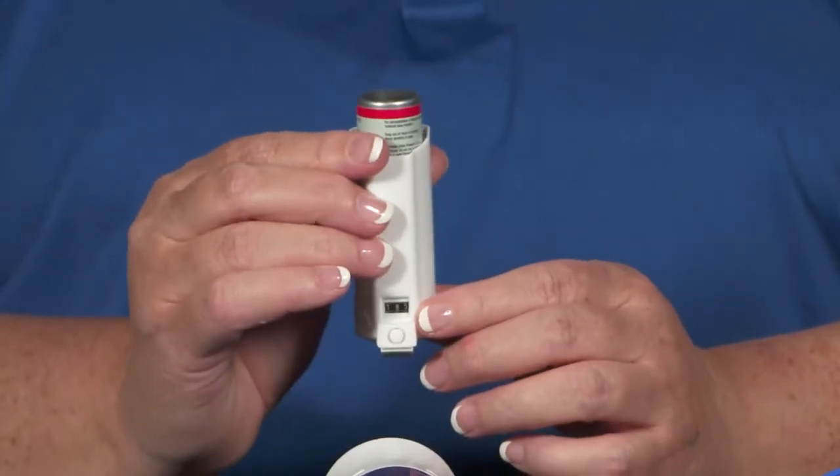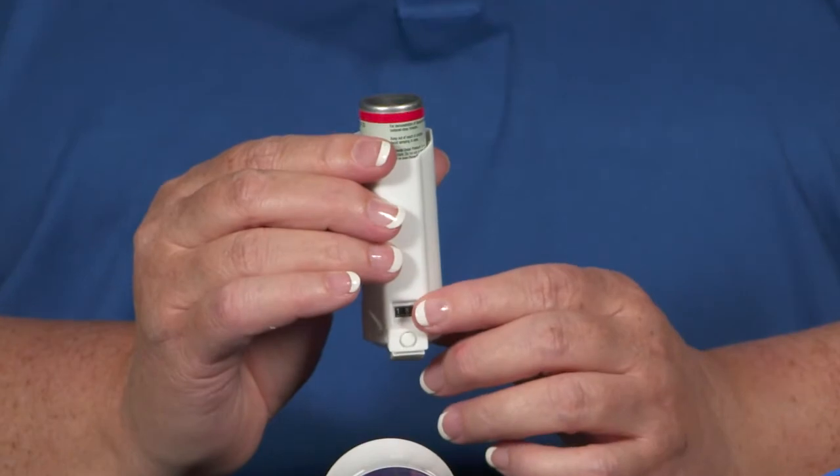When you first get your MDI and it's new, please ask an adult to help you prime it, which means to get the medicine ready. After it's primed and ready to use, the first thing I want you to do is to look here to see what number it's on. If the number is 0, it's out of medicine and you need to get another MDI. If the number is bigger than 0, then you're good to start.